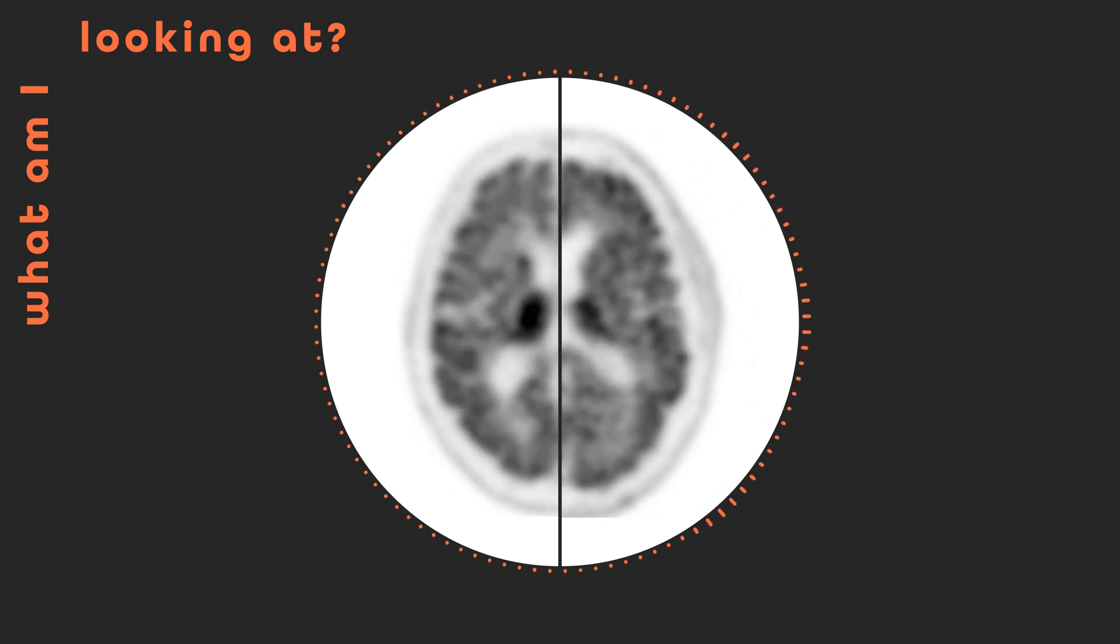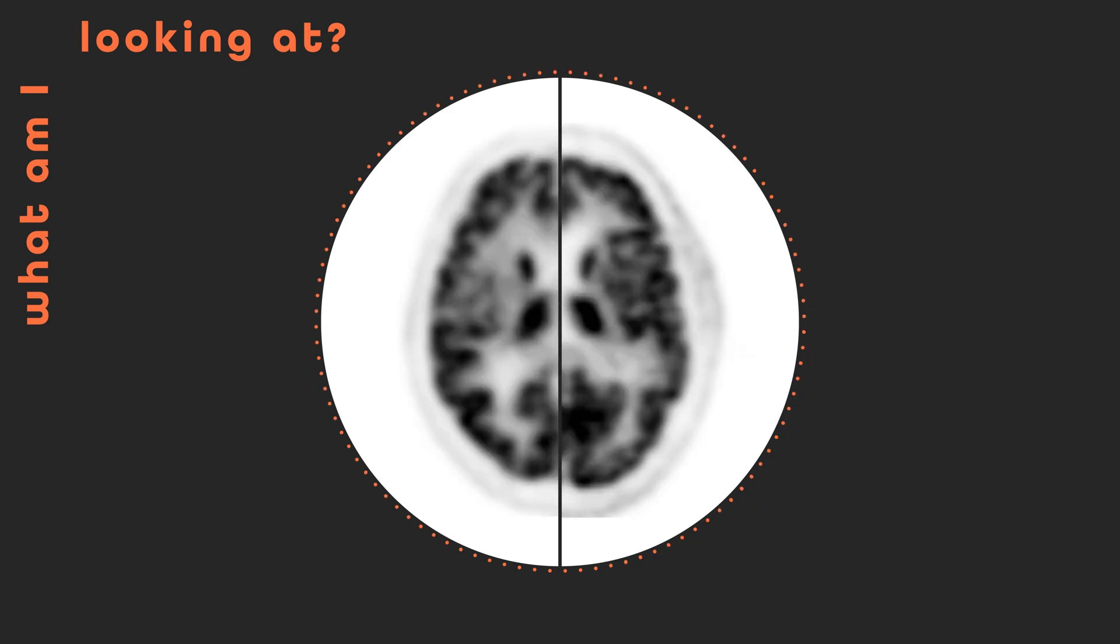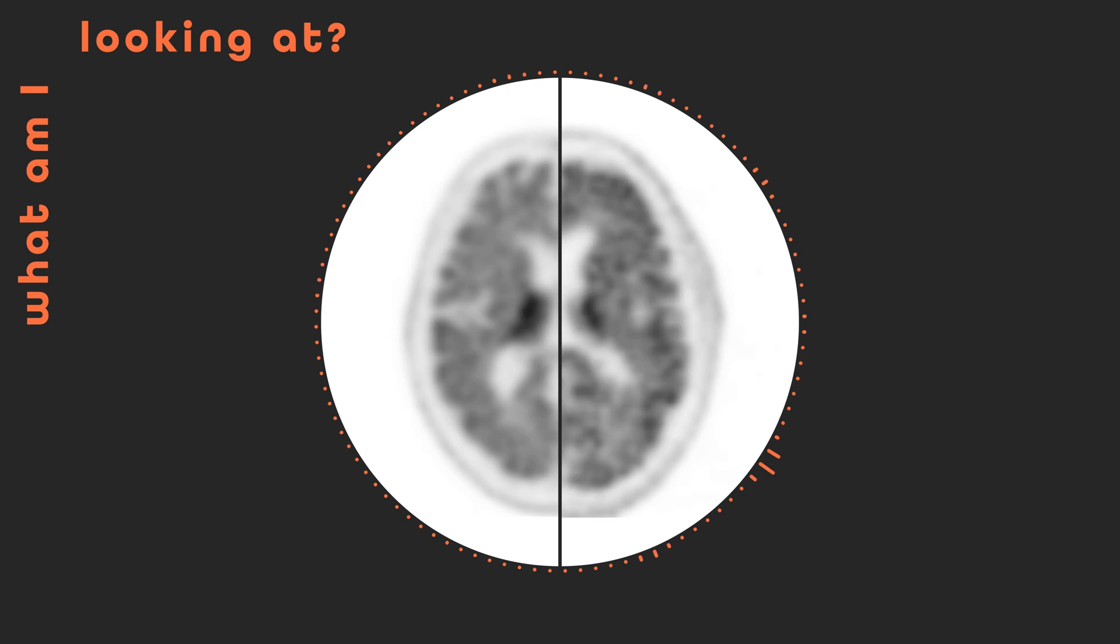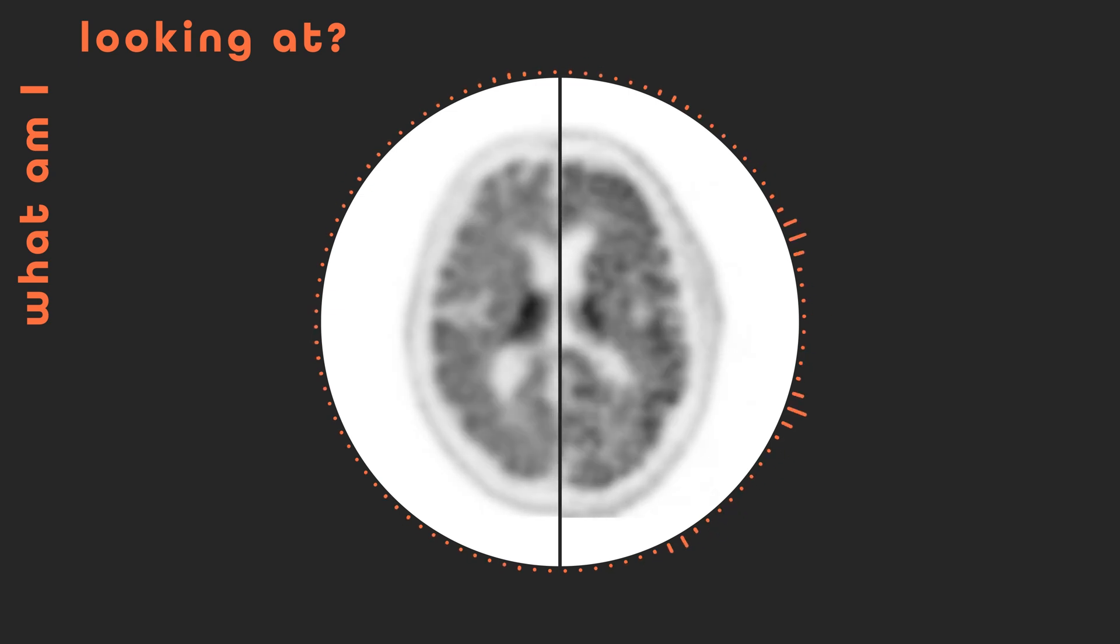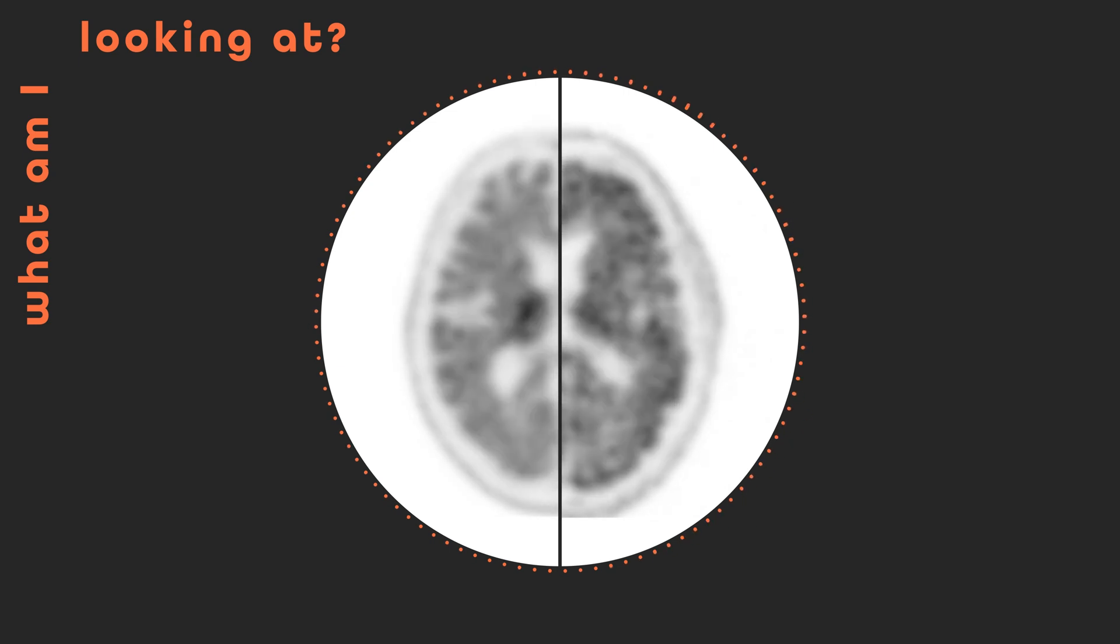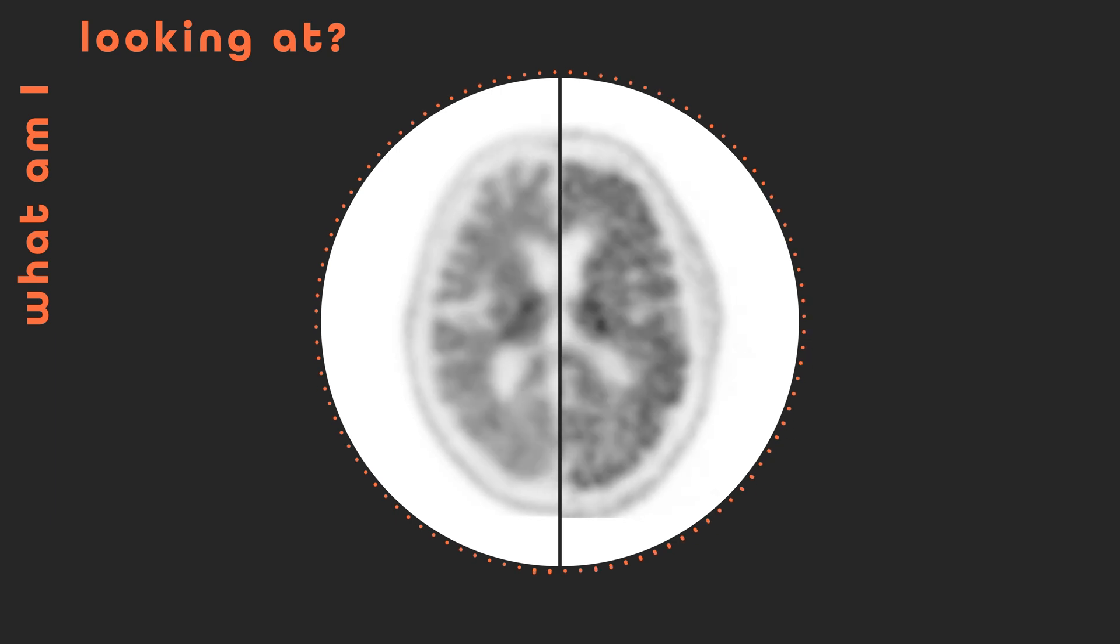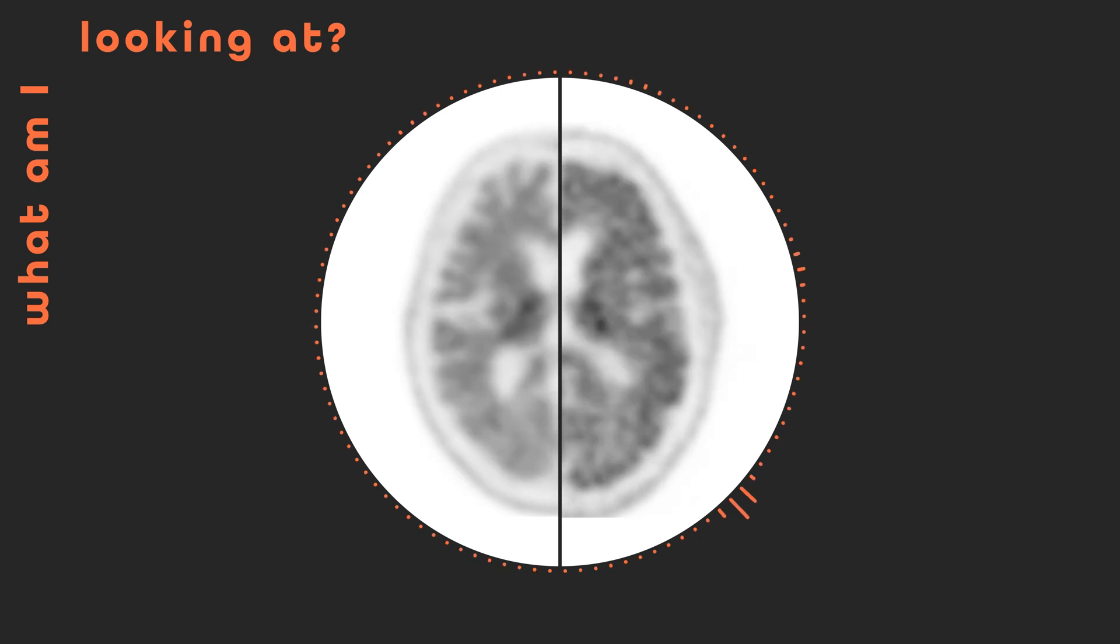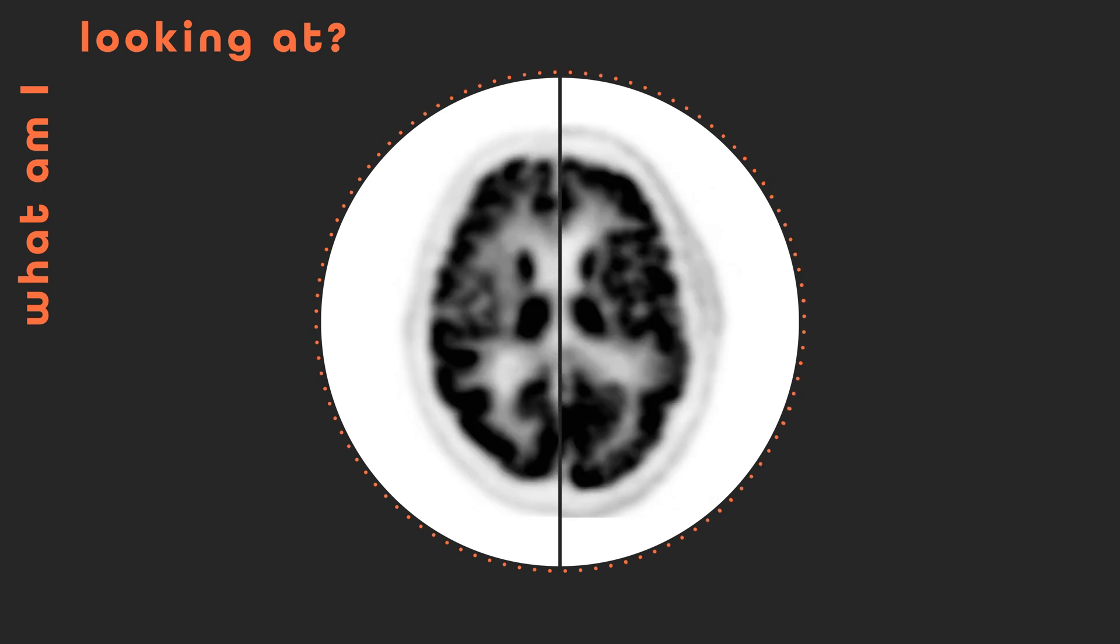Over time, the tracer binds to beta-amyloid plaques. These are clumps of proteins that can build up in the brain. As the video progresses and the tracer settles, a subtle difference between the two brains begins to emerge. On the right side, you may notice darker regions in one patient's brain, especially in the outer layer known as the cerebral cortex, which handles functions including memory. These darker regions indicate a high density of beta-amyloid plaques, one of the hallmarks of Alzheimer's disease.